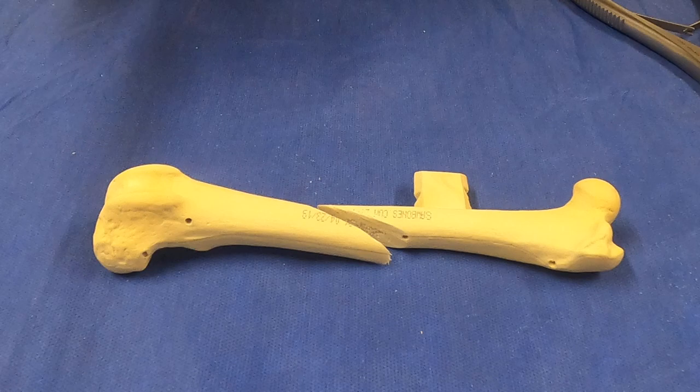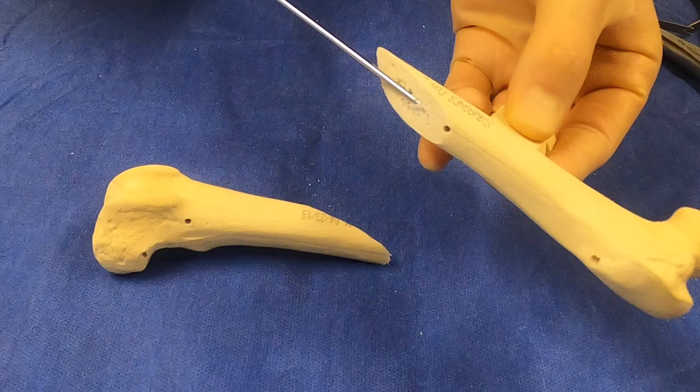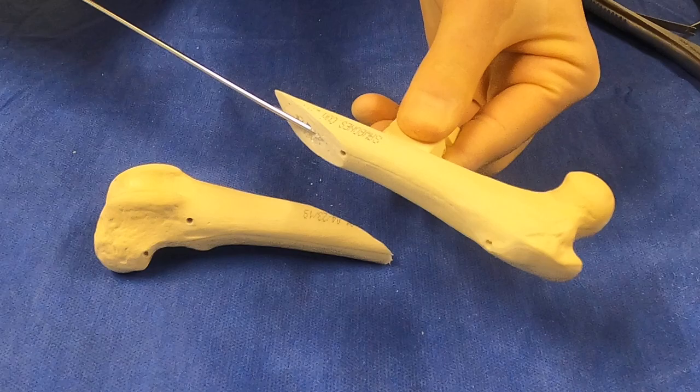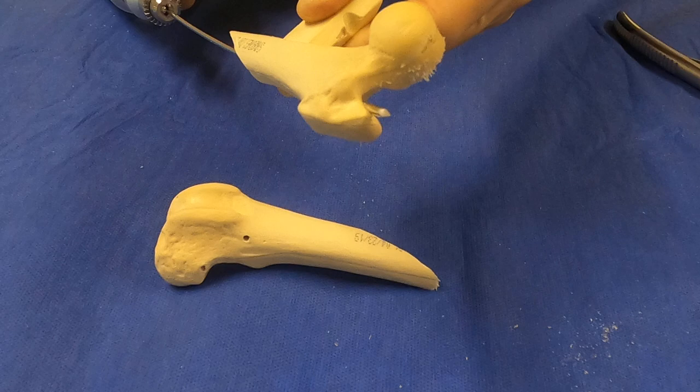Retrograde pinning is often thought to be easier because you're at the fracture site. We would take an IM pin, insert it from the fracture end, and come out approximately here — just medial to the greater trochanter.